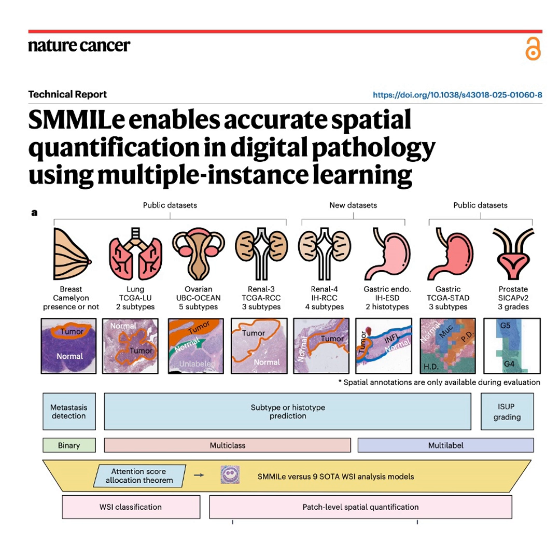And this is arguably the most counterintuitive part of the whole framework: parameter-free instance dropout. Wait, hold on. You're telling me it intentionally drops data? It does. The report says it stochastically removes the highest scoring instances during training. Why would an AI voluntarily put on a blindfold during a test? I mean, we want it to find cancer.